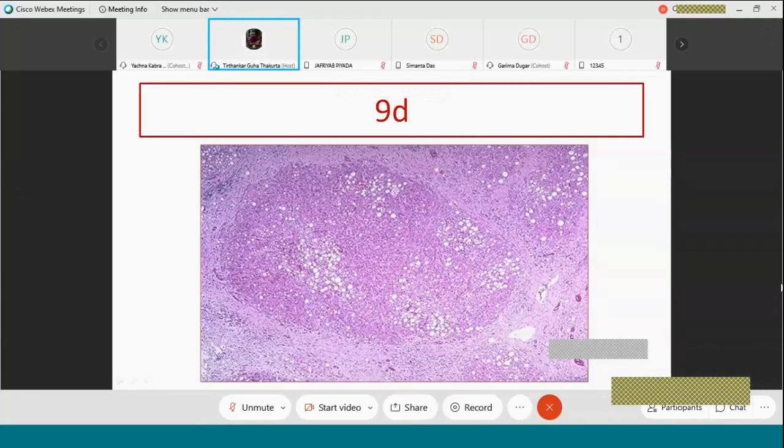So in a similar manner, when the diagnosis is fatty liver and cirrhosis, since cirrhosis is much more severe and an end-stage disease, you do not call it steatocirrhosis, you call it simply cirrhosis. Since hepatitis and steatosis are both reversible, they can be reported together. But when an irreversible process has already happened, the irreversible process becomes the diagnosis, not the reversible process. So even though there are fatty changes, since cirrhotic changes are present, the diagnosis will be cirrhosis of liver.